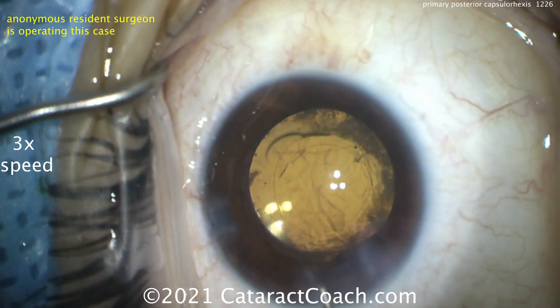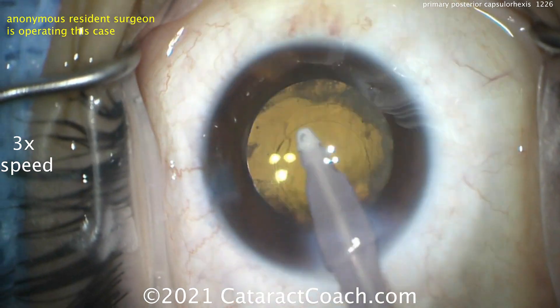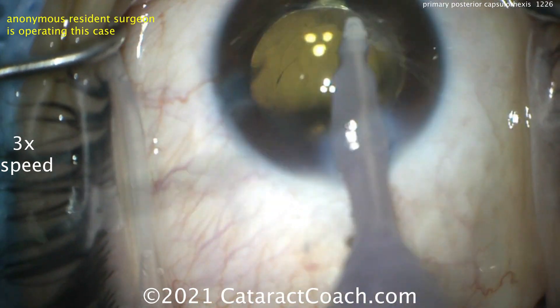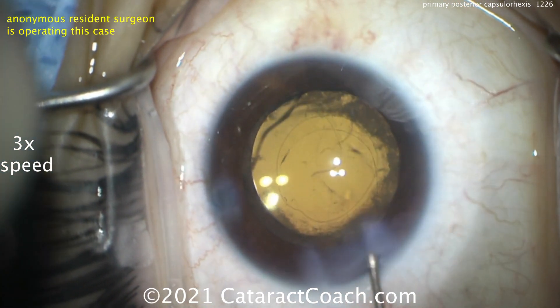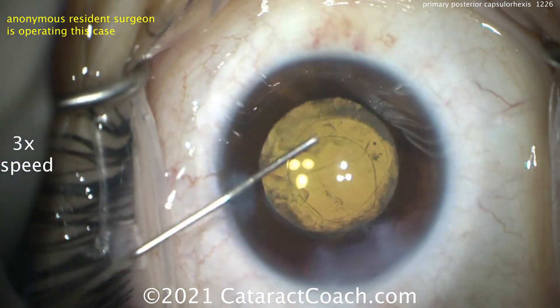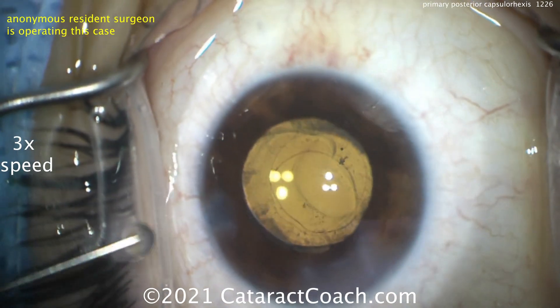Now we remove the viscoelastic. First let's seal up the incision a little more, then remove the viscoelastic from the eye. Don't go behind the IOL. To make this more stable, you can decrease the aspiration flow rate — you don't want the eye to collapse. Keep the eye inflated at all times, don't let the AC collapse. We can use the angle sweep method and inject BSS to make sure there's no more viscoelastic stuck in the angle — you can see a little bit coming out right now, and that can all be flushed out.